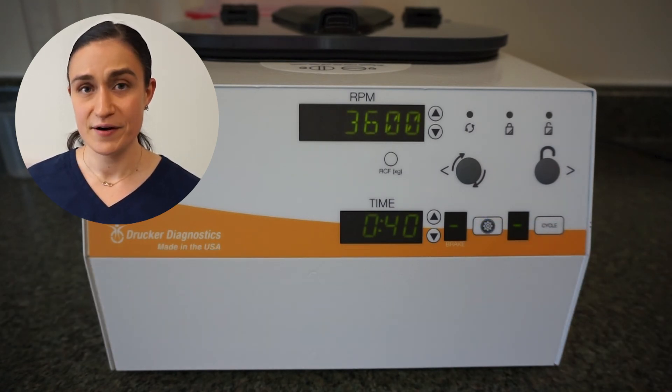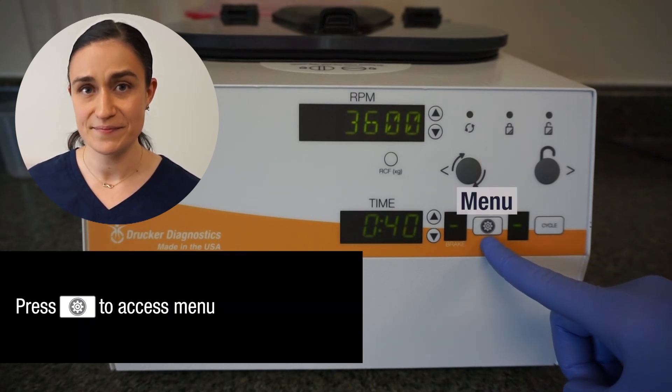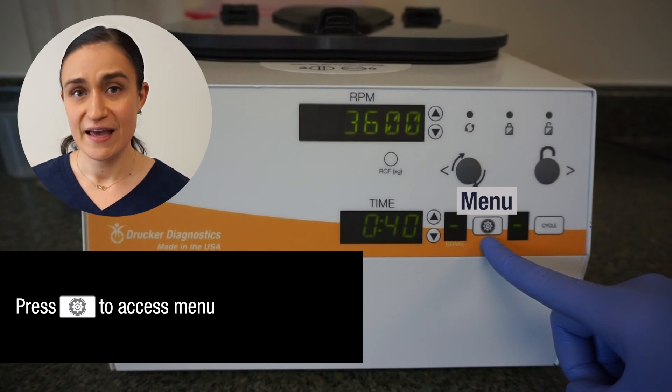Next to that brake indicator, we have the menu button. This is used to access the advanced menu, which will allow you to adjust braking and other more advanced settings on the SARA-12.